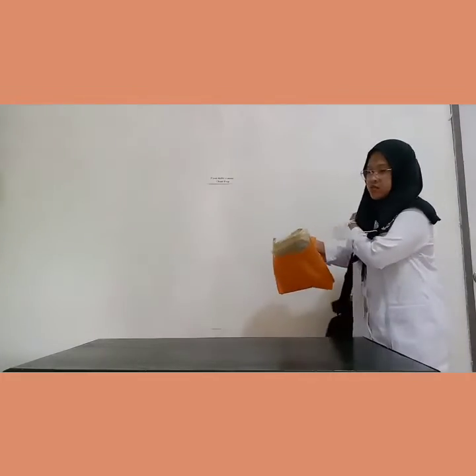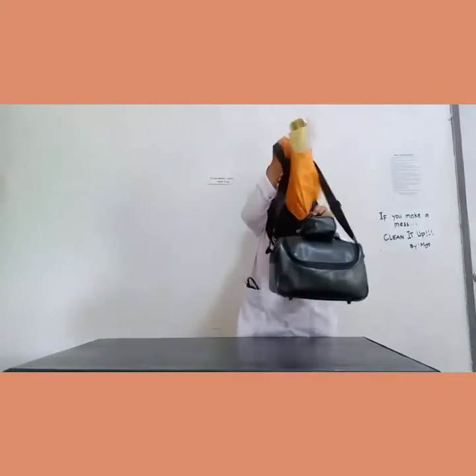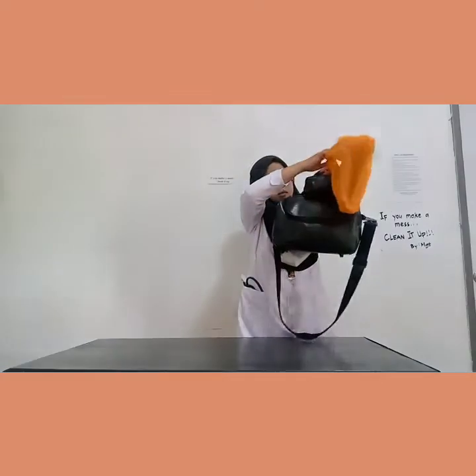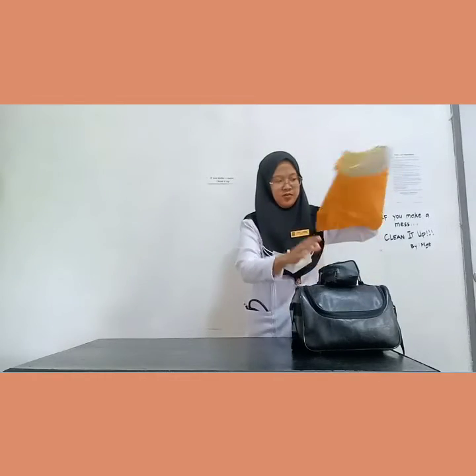The thing that we need to consider before, during, and after the procedure is to maintain the sterility of the bag and to prevent contamination. Upon arrival at the client's home, place the bag on a flat surface or on a table lined with a clean paper lining, clean side out, fold part touching the table. Put the bag handles or strap beneath the bag. This is to protect the bag from contamination.